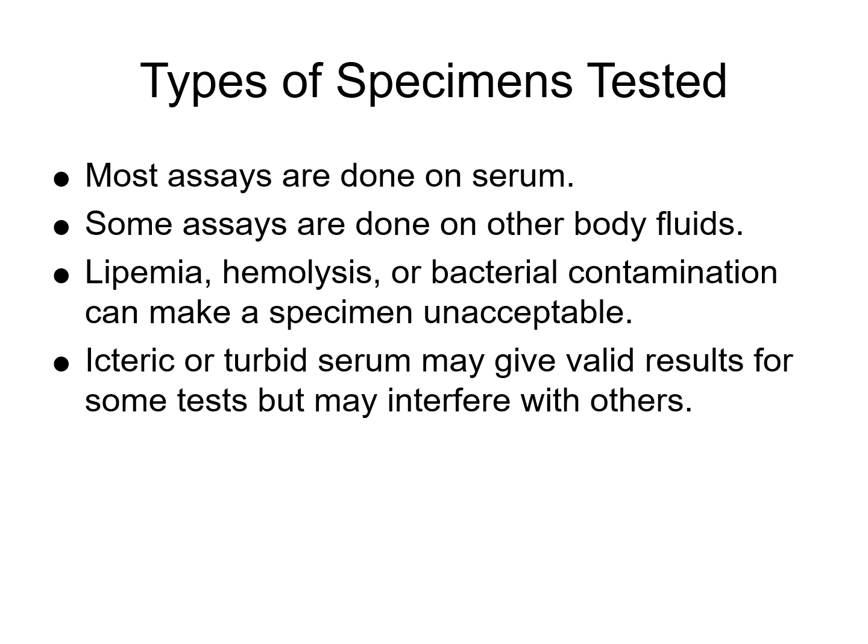Potentially interfering specimens: icteric, the ones that have high bilirubin, or turbid serum. They could yield a valid result for some tests, but they may interfere with other assays depending on the test sensitivity. So the best practice is to inspect specimens for clarity, color, and contamination before testing. You want to make sure you follow the protocol-specific guidance for handling specimens with minor interference. You're also going to document any specimen issues in the laboratory record.